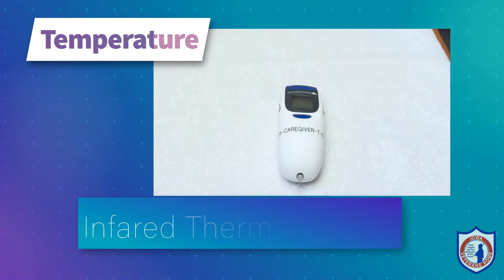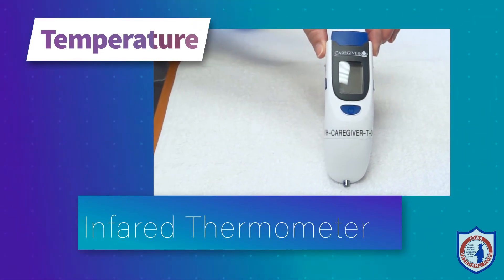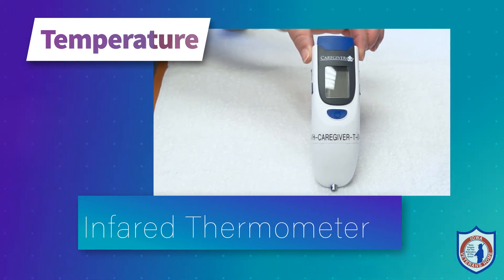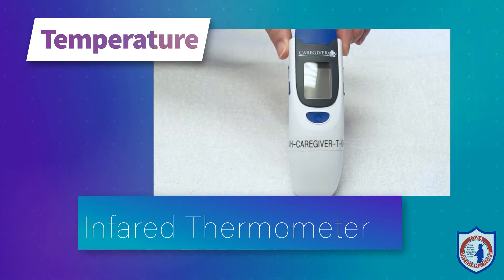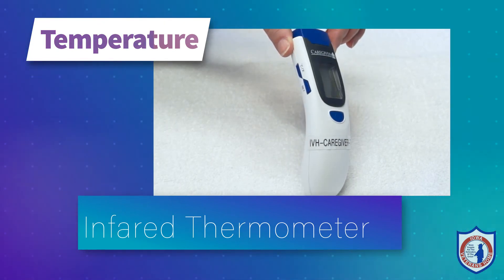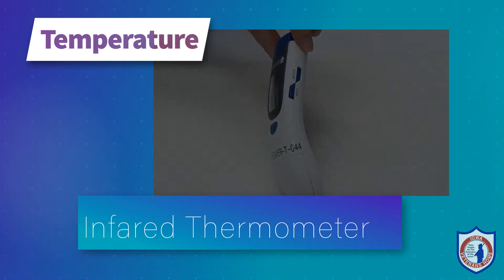We are starting today with measuring body temperature. The Iowa Veterans Home utilizes two types of thermometers to measure body temperature. The infrared thermometer does not touch the body and can be used to monitor temperature by directing the infrared at the forehead. The forehead should be dry as moisture can interfere with an accurate reading.